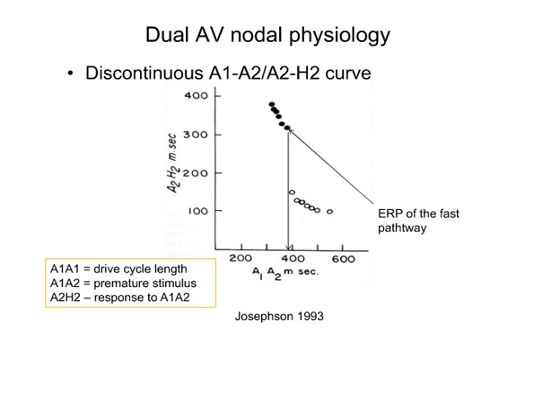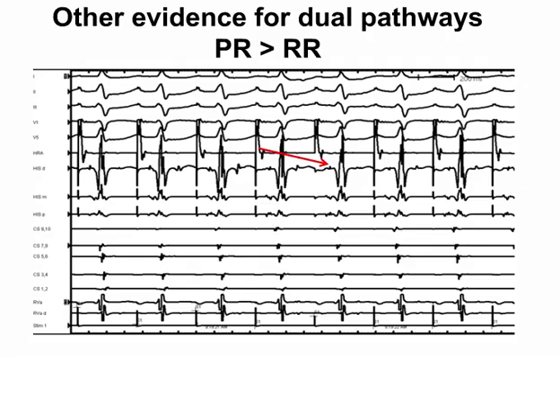That's clearly something we look for, because very frequently, if you have a jump, you're going to be observing AV node reentry. But it's not the only thing you can see with jumps, because sometimes orthodromic AVRT requires a jump in order to initiate. So don't get fooled into thinking that just because you have a jump it's definitely AV node reentry. It could be other forms of tachycardia.